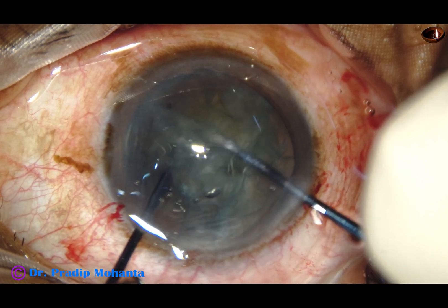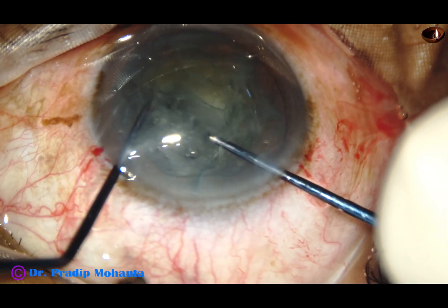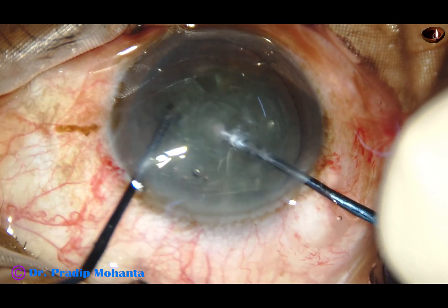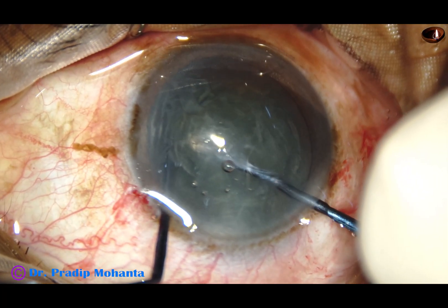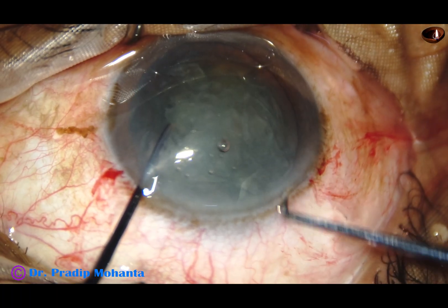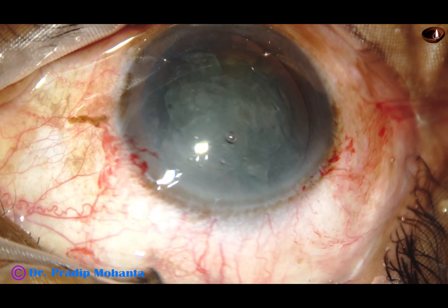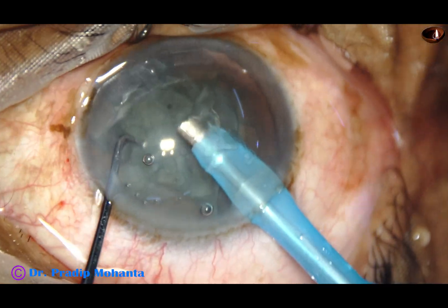Pre-chop one hemi-nucleus, and now at this stage you can come out, inject visco, fill up the entire chamber, and try again to pre-chop the other hemi-nucleus. But in this case, I'm doing it for five years so I can manage in a shallow chamber also without causing any damage to the cornea. But I suggest you come out, fill up the entire chamber again with visco and then try. You can even crack only one hemi-nucleus and manage. But if you want, you can divide both hemi-nuclei.